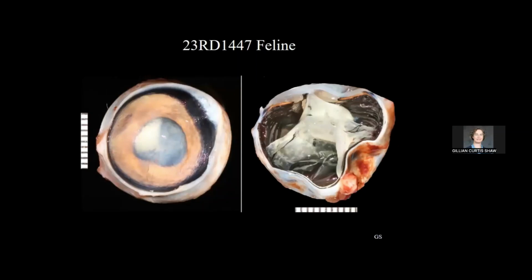All right, this is a cat whose name, if I say it, might be known to people out in the world, so I won't say it. It's got a funny name. Anyway, this is an 11-month-old. I know, just gonna tease you. An 11-month-old spayed female domestic short-haired cat. I will tell you, it was an island cat from Turks and Caicos.